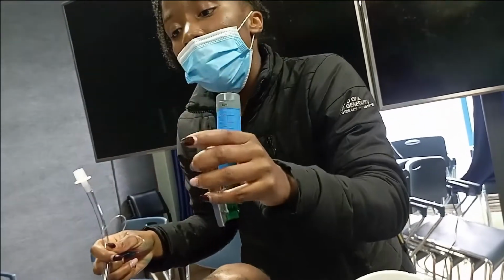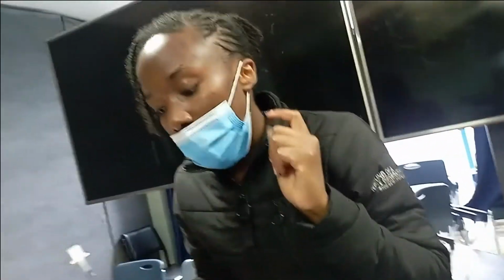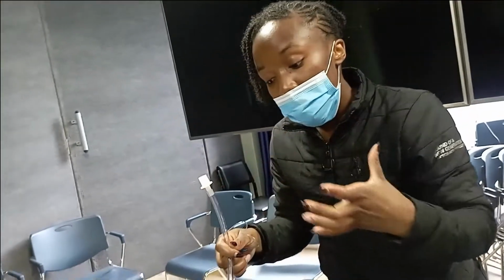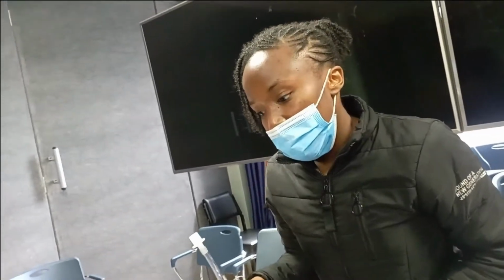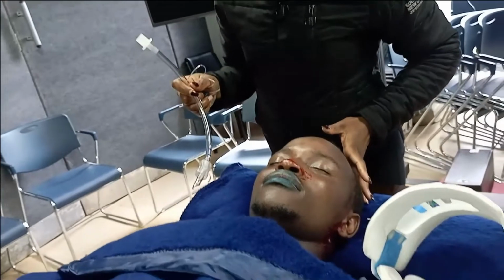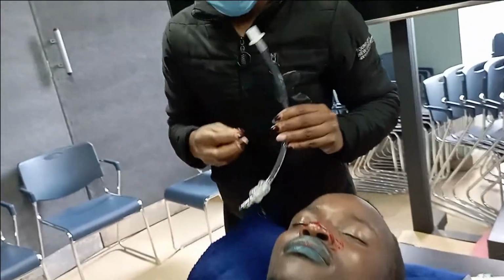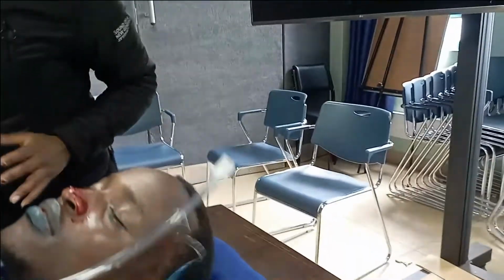Okay. And then yes, we auscultate the epigastrium. We look for fogginess along the tube. So you confirm the tube is in place? Yes. And then we connect the ventilator. And then we look at the capnography. After that, we secure the ET tube in place. And then we reassess for oxygenation. Oxygenation has improved to about 86% from 80. At this point, we already have a definitive airway. Yes, our C-spine collar is in place. So we move on to B.